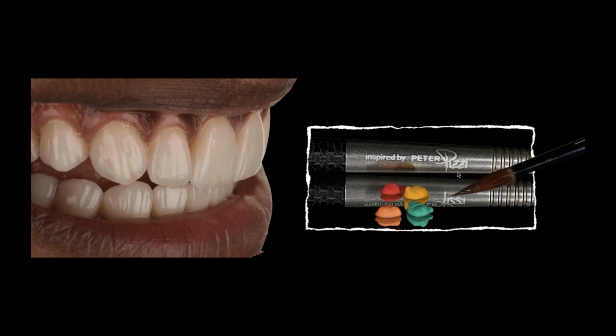I've done them without it and it works just fine. I've also made my own mixes in times where I use a fluorescent stain, like a white fluorescent stain, and kind of painted that on too. I don't know if you 100% need it, but out of habit, I keep using it. So for me, I'm using the GC connector paste for it.